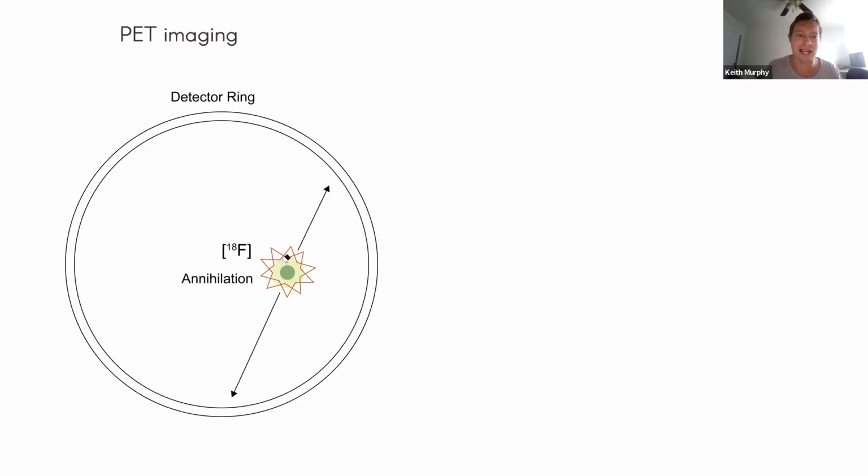This is a PET scanner. And as these molecules annihilate, they essentially send out these, I guess they're like photons, right, Kim? Yeah. So the photons are shooting out and you can detect the time it takes for them to get to each detector, and you can localize where the source of them are. And you can aggregate that signal over time.